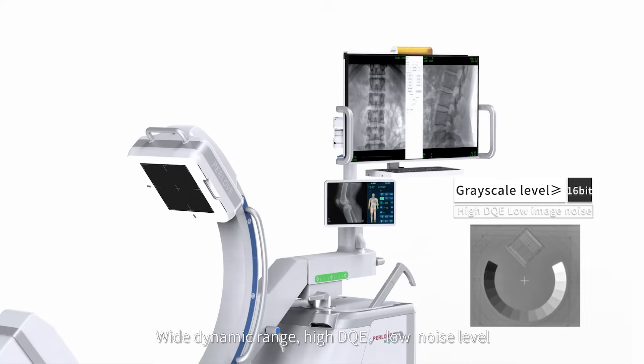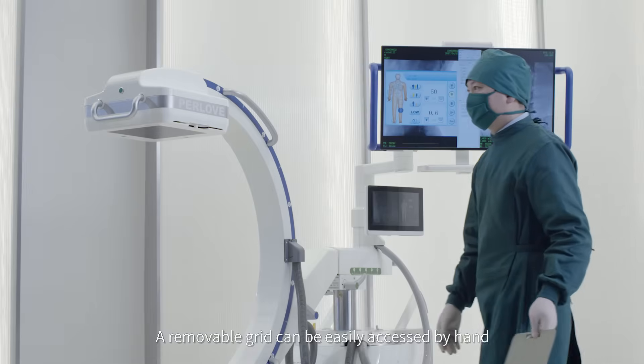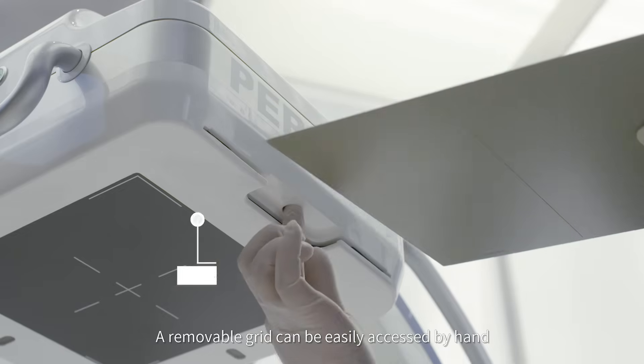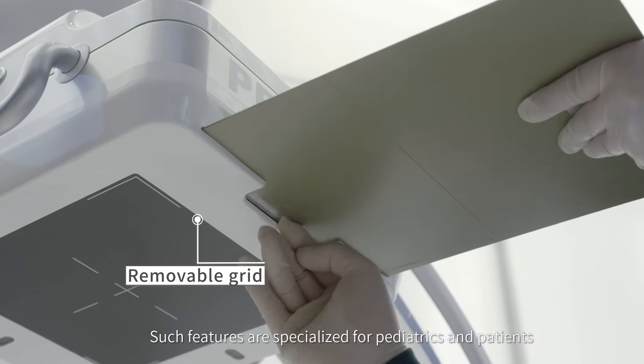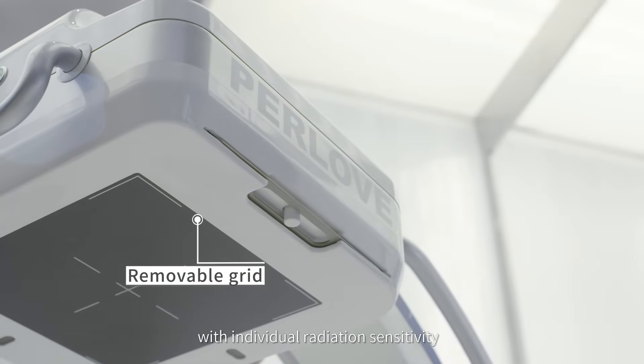Wide dynamic range, high DQE, and low noise level — an excellent image chain guarantees a variety of clinical diagnoses. A removable grid can be easily accessed by hand, specialized for pediatrics and patients with individual radiation sensitivity.